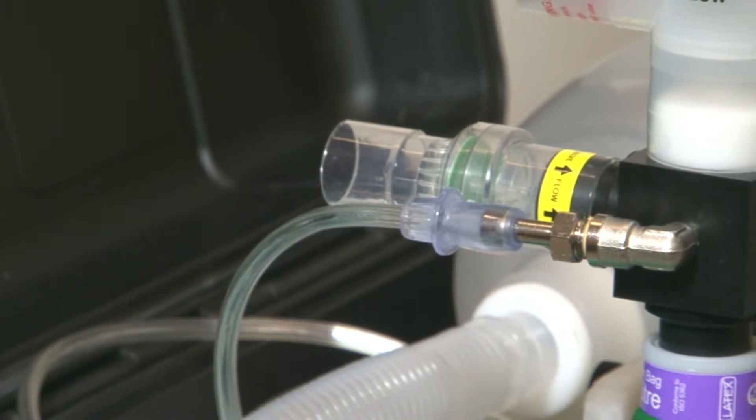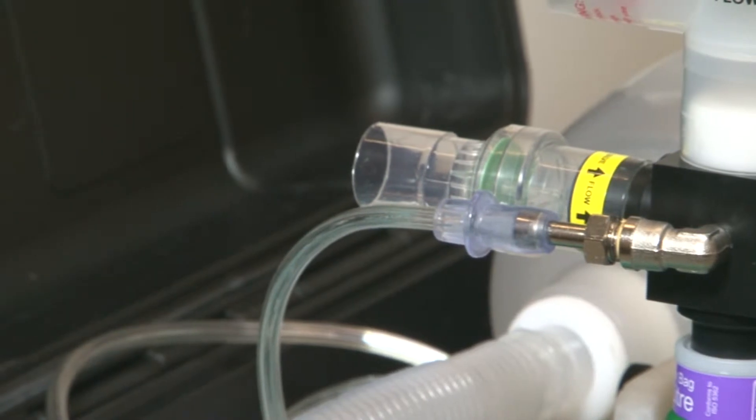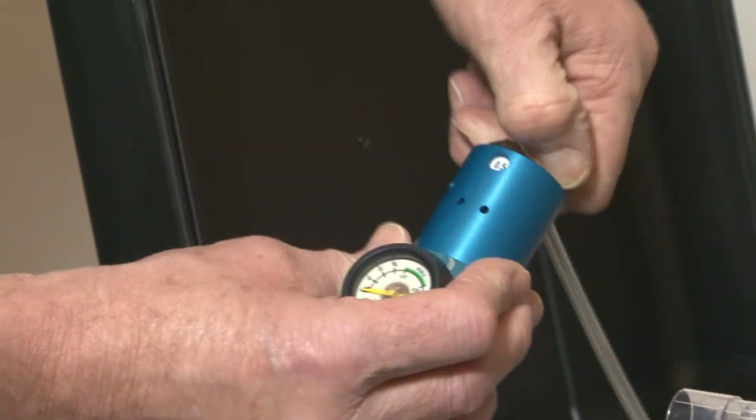Supplementary oxygen can be added to the system through this tube, either from an oxygen concentrator or from an oxygen cylinder using the regulator flow meter supplied.